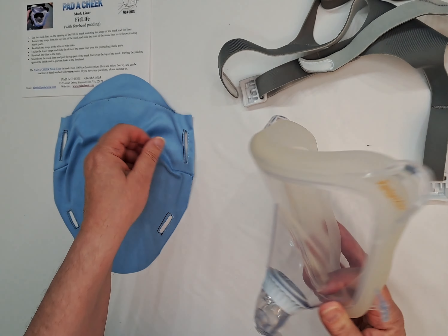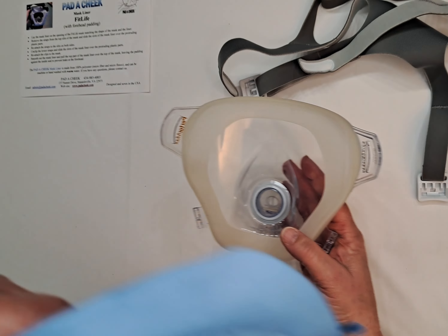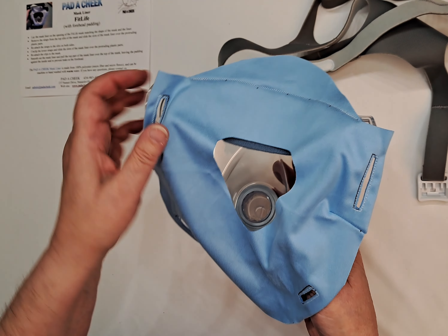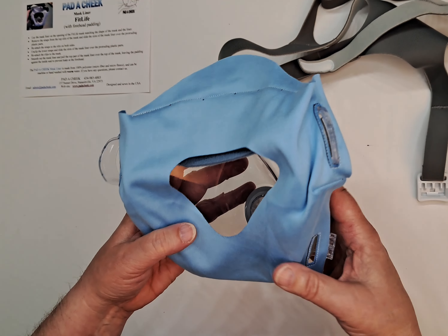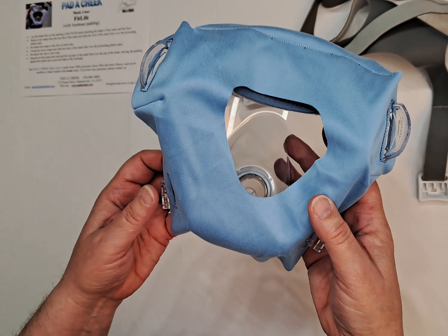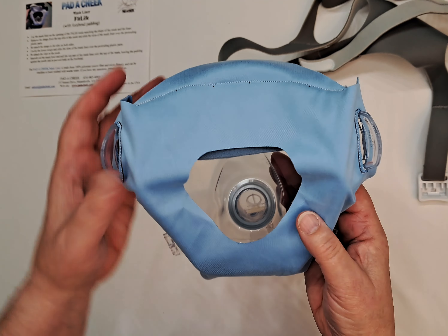Take the mask liner and lay it over the FitLife Mask, matching the shape of the hole. Take the side strap attachment tab and slide it through the slit on both sides. Same on the bottom. It should look like this.